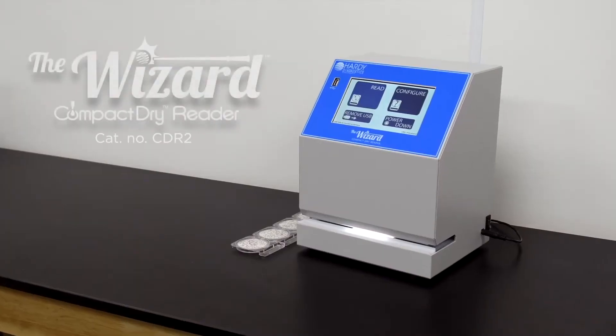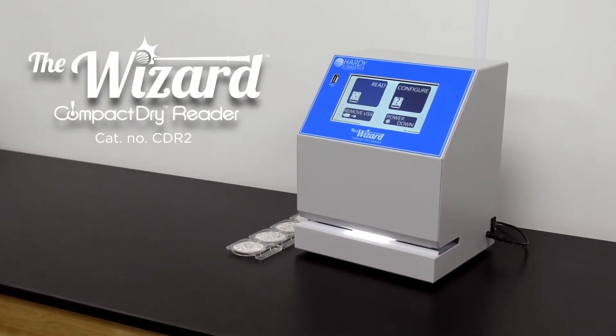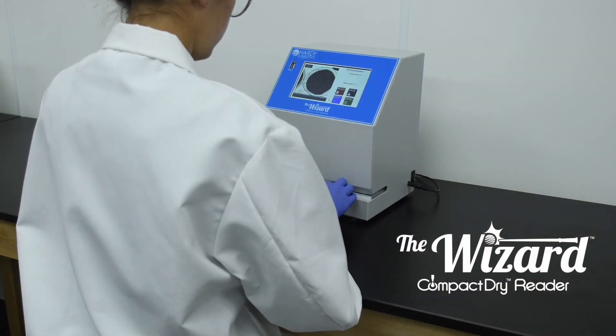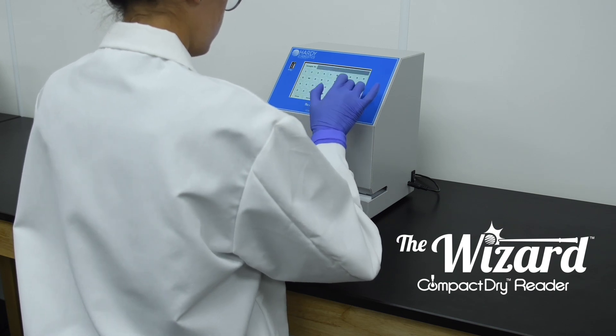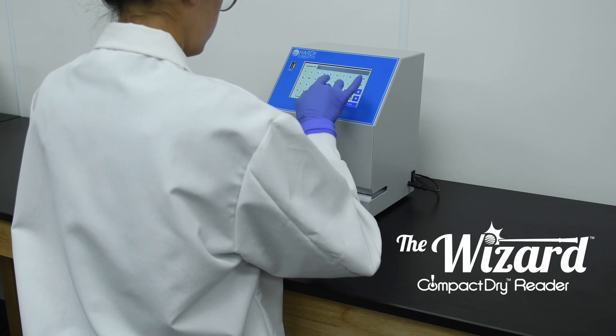Count the number of colonies on the new Wizard CompactDry reader. The Wizard CompactDry reader, designed exclusively for use with CompactDry plates, automates the plate reading process and saves technicians time. Your technicians will thank you.